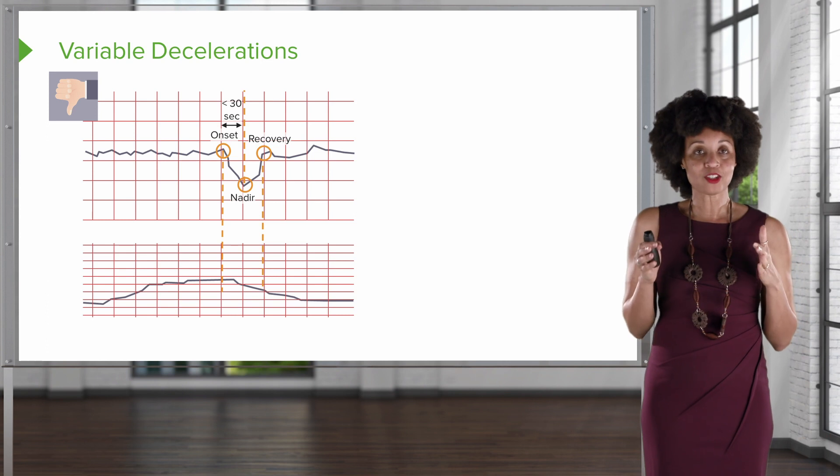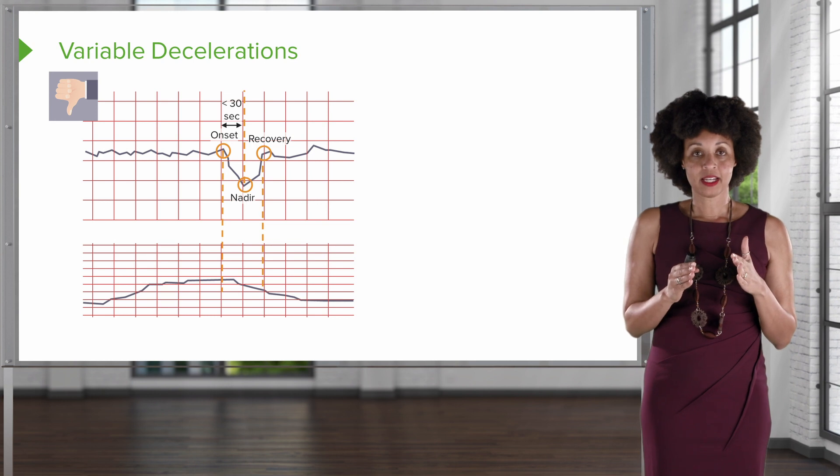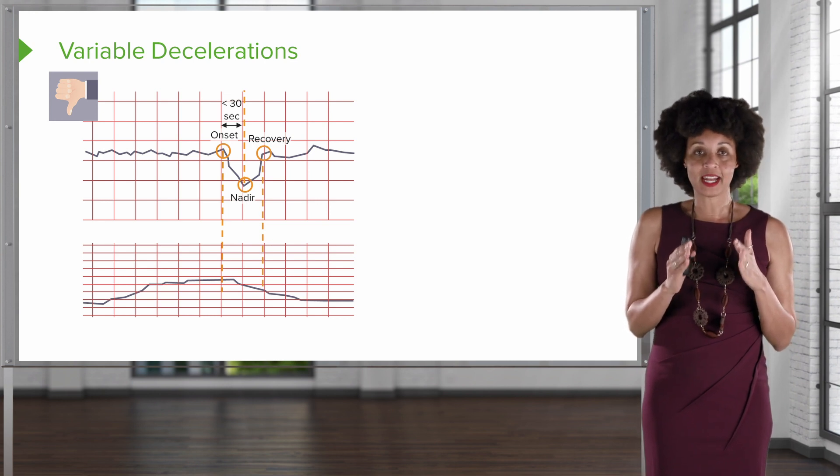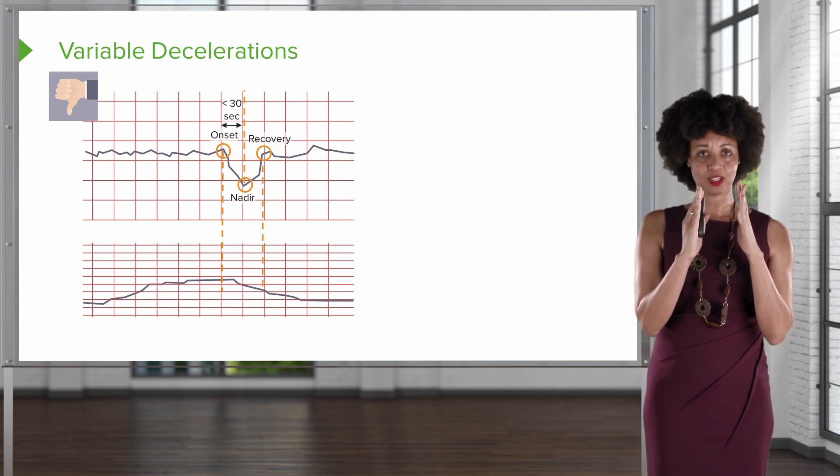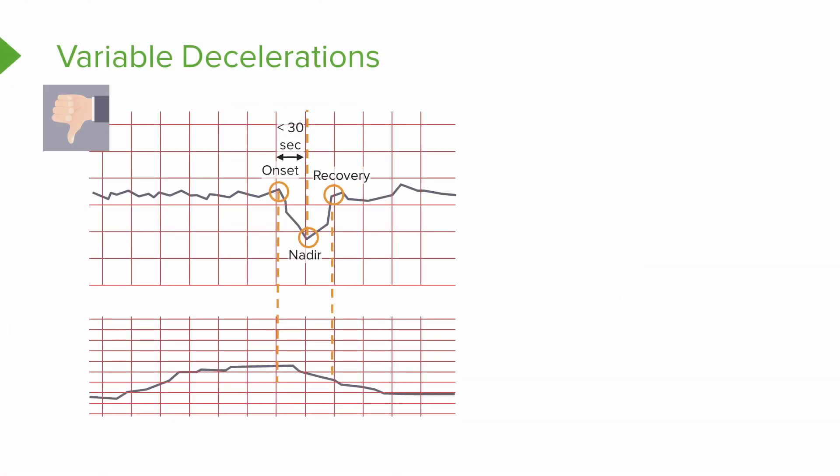Let's look at this third type of deceleration and let's talk again about what is different. Now the first thing you may notice is that it's very short in terms of when it starts and when it gets to that lowest point. That's a very rapid descent. It's less than 30 seconds if you need a quantitative measure. It's not as wide as the early or the late decelerations that we looked at. That is characteristic of a variable decel.